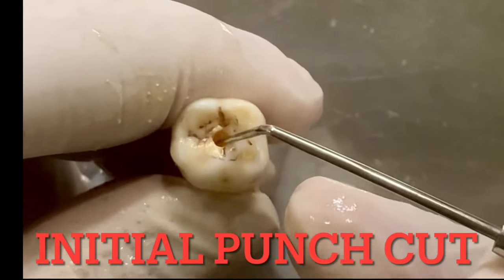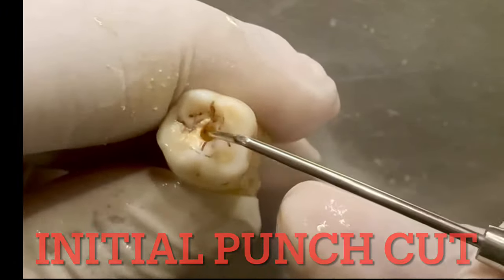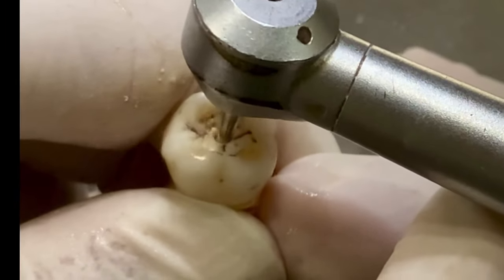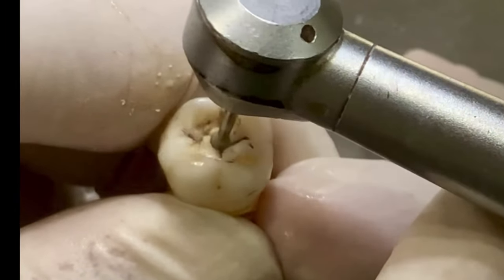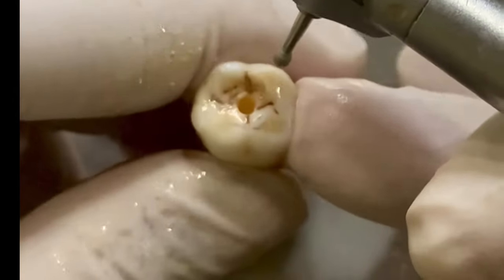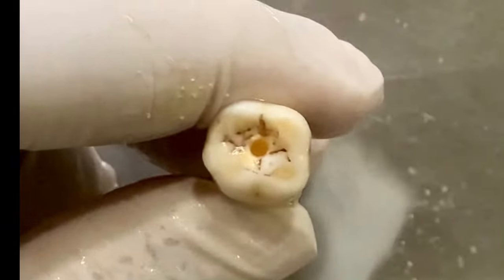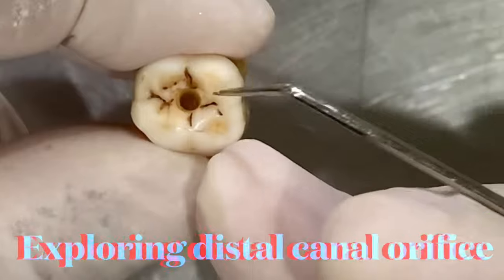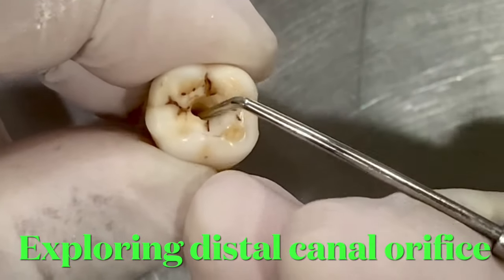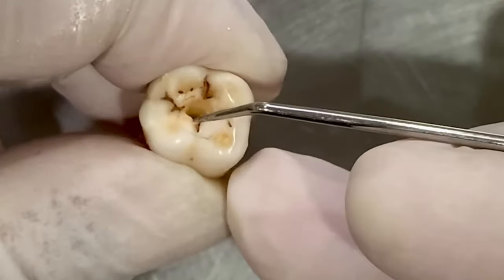We've made a notch here in the enamel, but we need to go deeper in the same direction. While cutting, I felt a dip, so now with the help of a straight probe I am exploring the area.